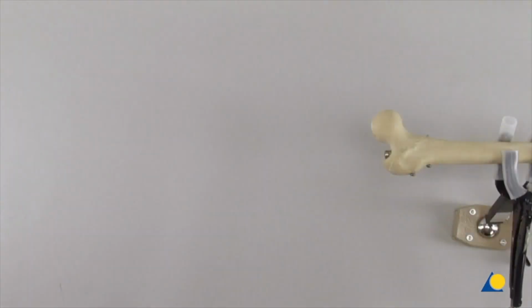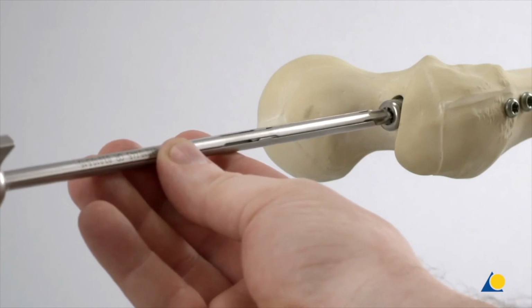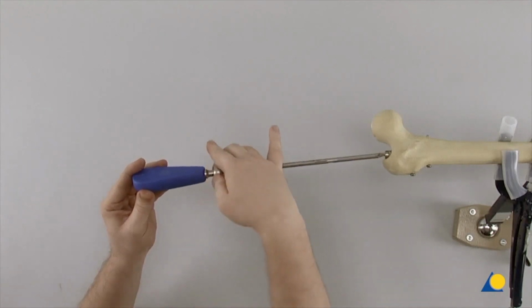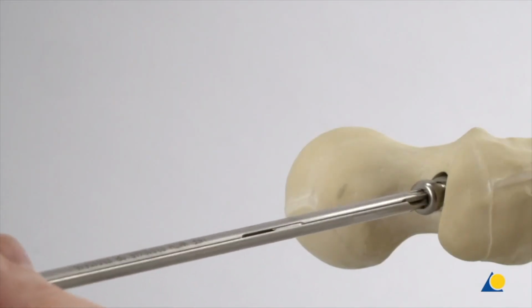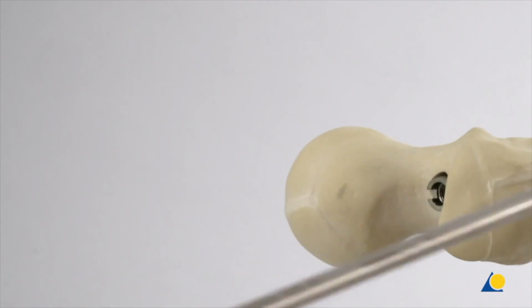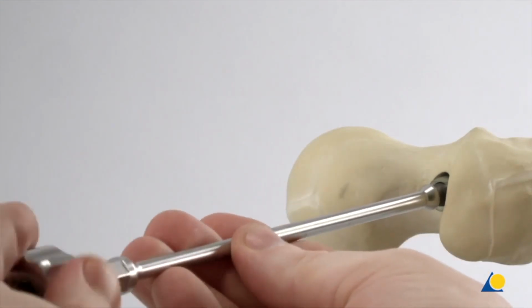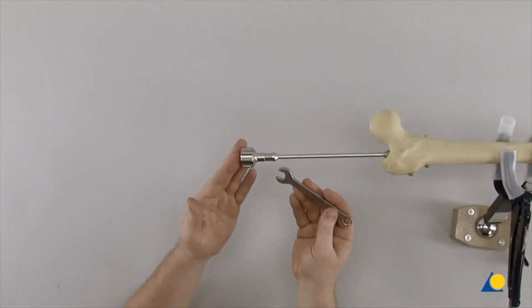Clinically, before removing the nail, all but one of the locking screws are removed. The most proximal locking screw is left in place for the time being. The interlock screwdriver is attached to the end cap and turned counterclockwise to remove the end cap. The extraction screw is manually attached to the nail and tightened with the combination wrench.